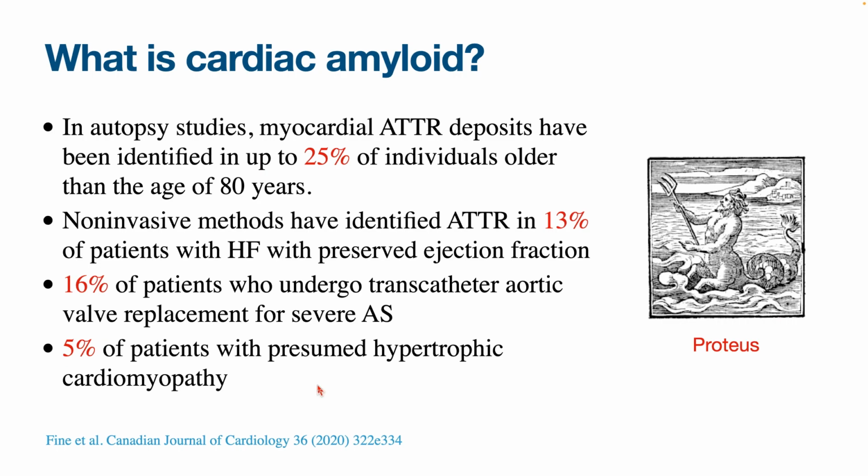So when patients come through our echo lab with thickened wall, it backs the discussion that we should be doing the GLS on a more regular basis, because you can actually pick these things up.